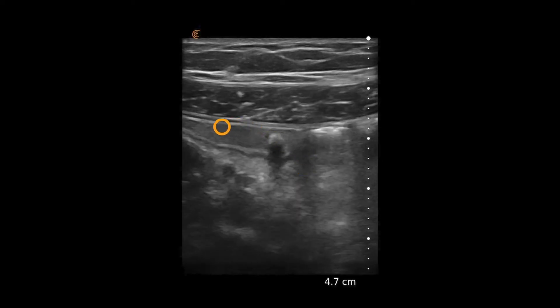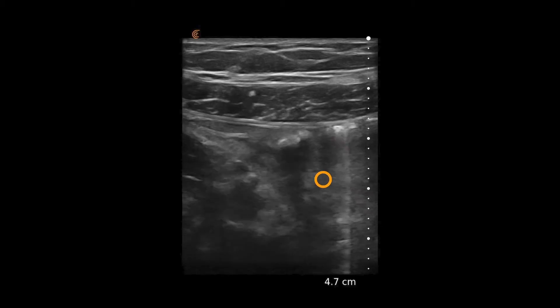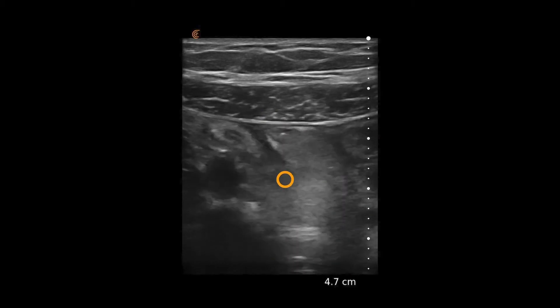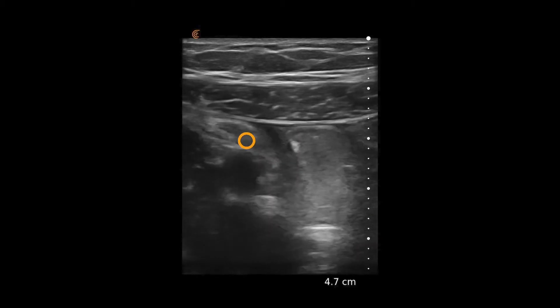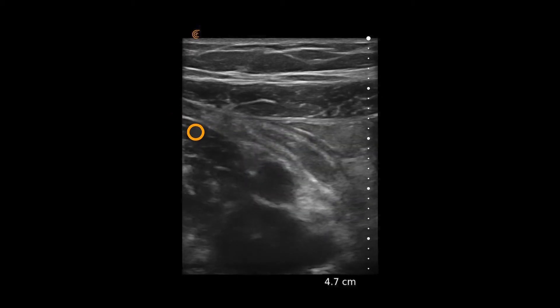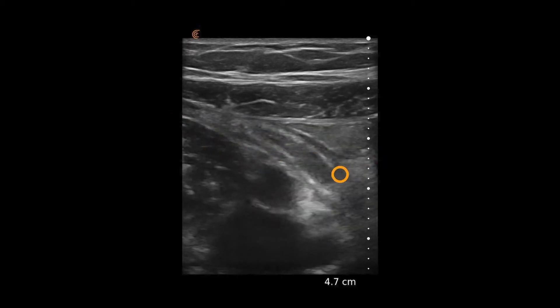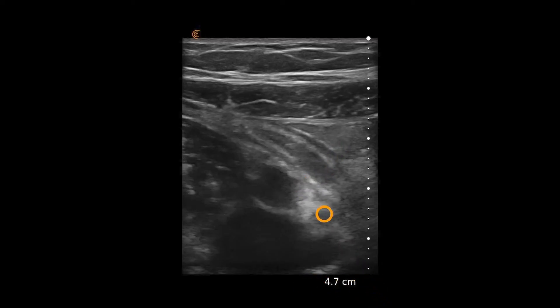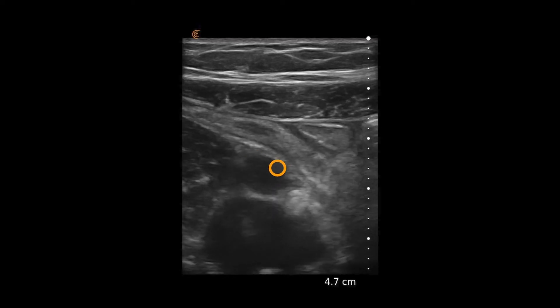Other findings that are considered secondary findings of appendicitis would be the free fluid that was seen, and here is some hyperechoic fat surrounding the appendix. The length of the appendix can be scanned back towards its entry, and here you can see clearly that its maximal diameter is likely approximating one centimeter, as demarcated by the depth gauge on the screen.